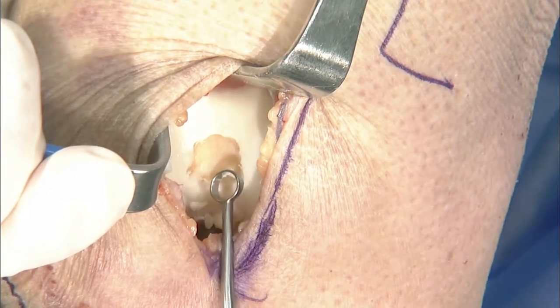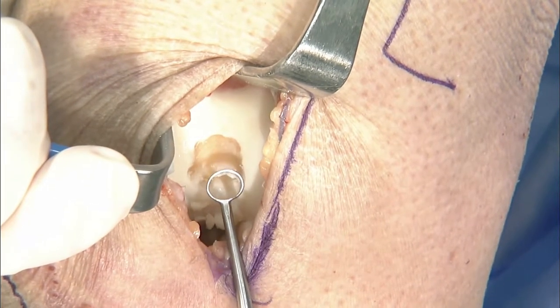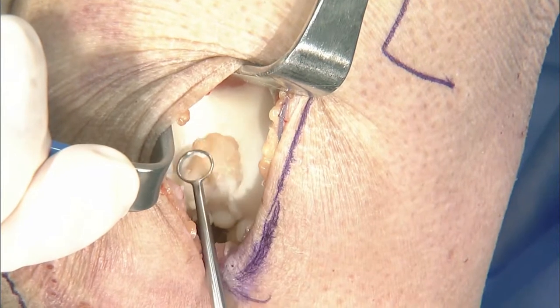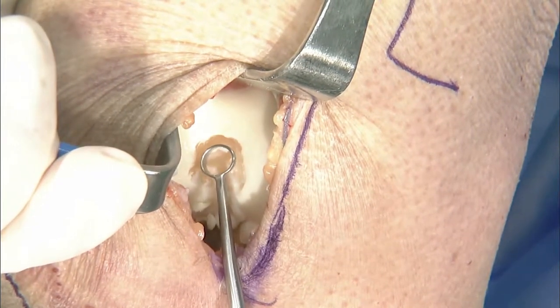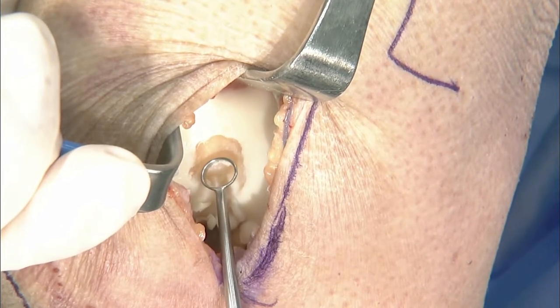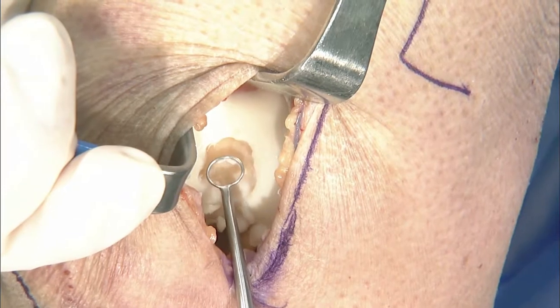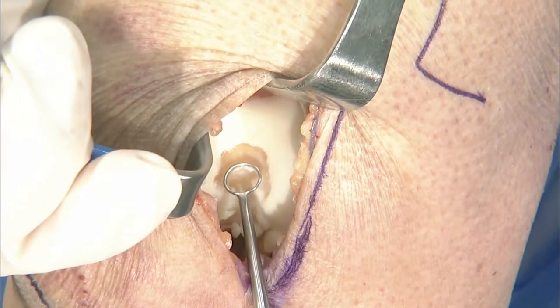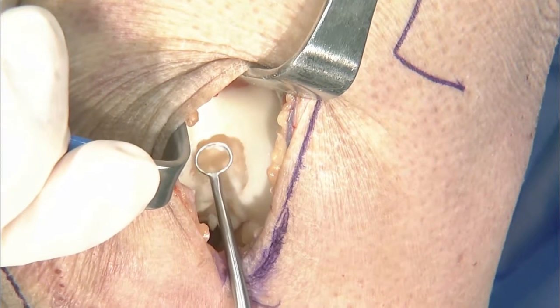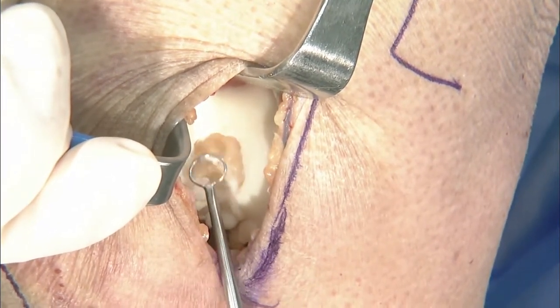I think one thing that can be difficult to deal with, where I don't know that there's a perfect answer, is any sort of intralesional osteophyte, meaning say that this was a cartilage defect that somebody's had for a while and that they've developed basically an osteophyte inside this lesion right here. What exactly to do for that? In the femoral condyles, they can be pretty hard and pretty dense. Typically what I'll do is start with a sharp ring curette and really try and get through it. Put some elbow grease into it and try and work it there.